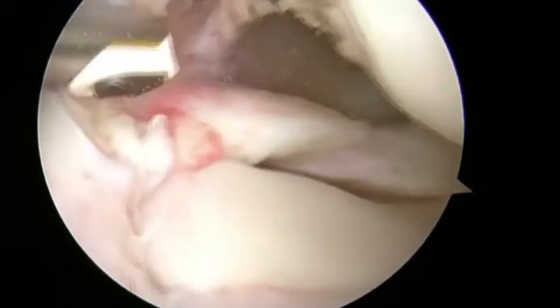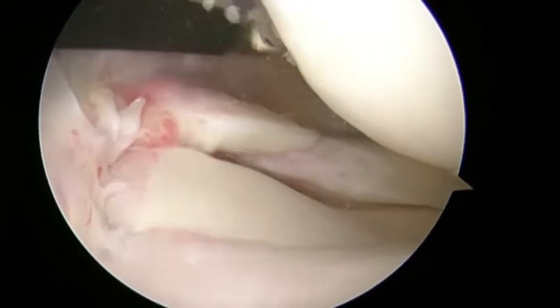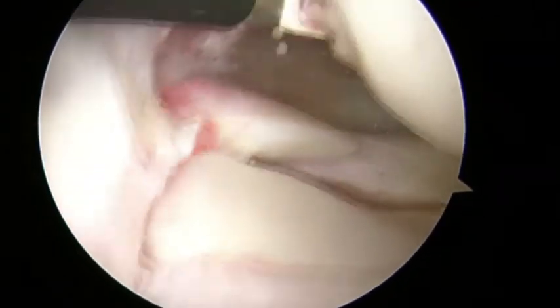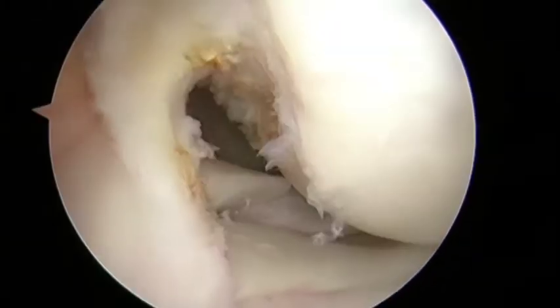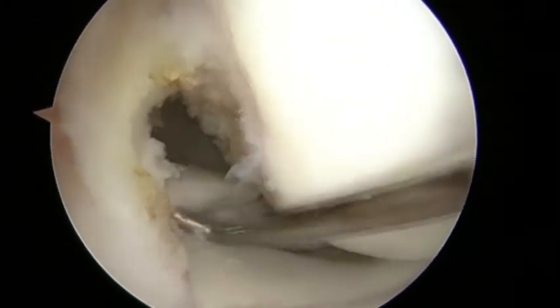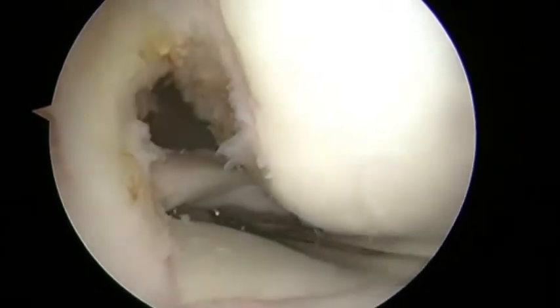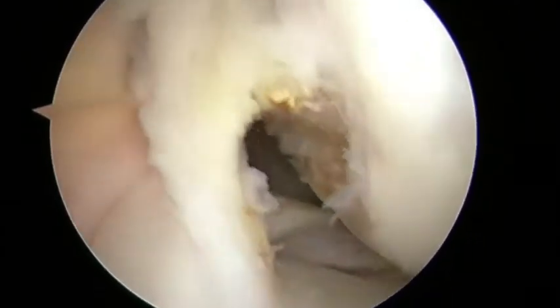This is a technique with the use of an antegrade suture passer for radial root tear repair. This is a left knee in a figure-of-4 position and we are viewing from the medial portal. This is a LaPrade type 4 lateral meniscus root tear with a significant lateral root stump. This type of lateral root tear is again not ideally repaired with transtibial pullout sutures.